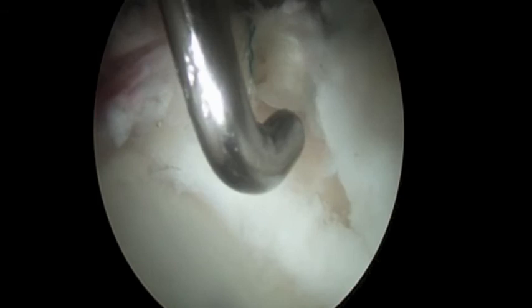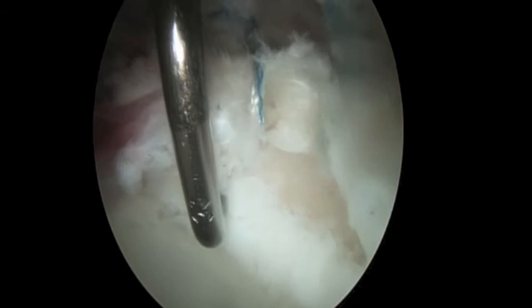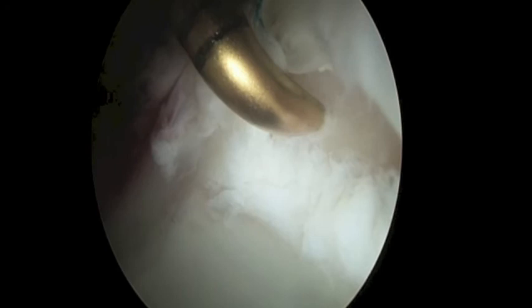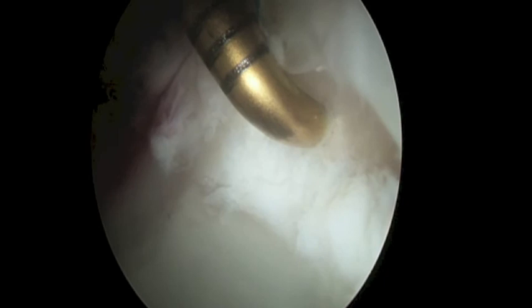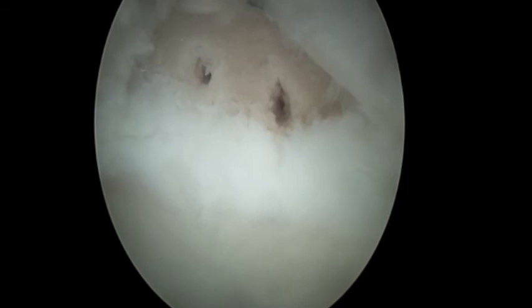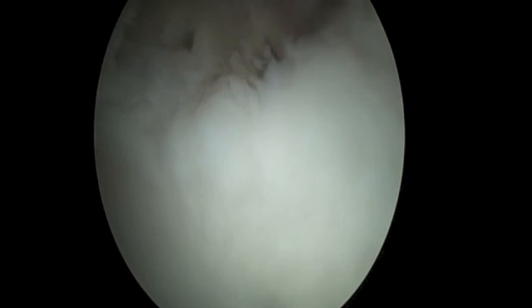The arthroscopic knots were tied superiorly to repair it. Here is our repair after those knots were tied. We were probing the labrum for stability, and you can see that it is secured back to the bone. In this case, because of the large defect in her cartilage, we performed a procedure called a microfracture, which is a cartilage regenerative procedure. You now see the microfracture completed along with the repaired labrum. We are looking around the remainder of the joint, and the remainder of her cartilage was in excellent condition except for this one area of damage.